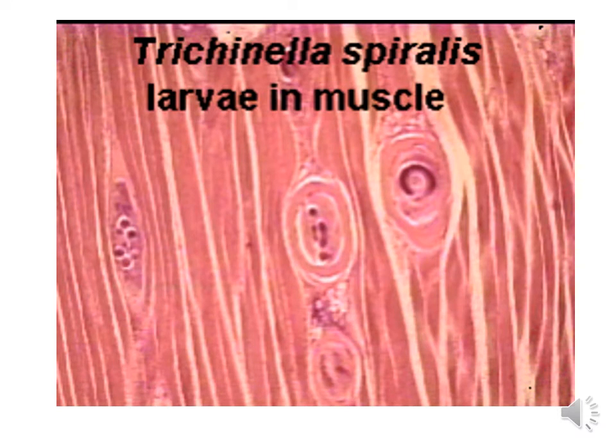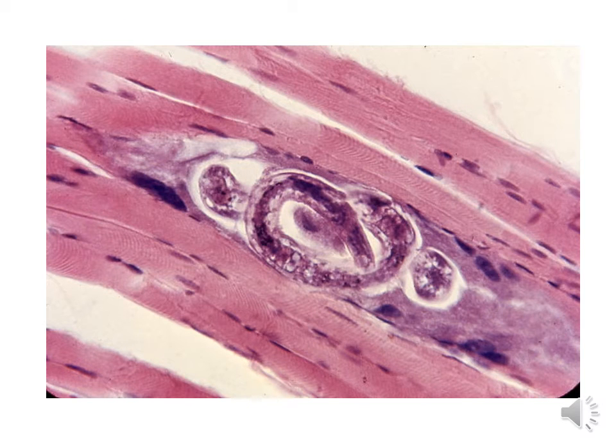Trichinella spiralis larva in the muscles, because Trichinella causes infection when people eat undercooked pork containing the encysted larvae. The encysted larvae will be released in the intestine, and then they become adult parasites, and it releases larvae which can enter the muscle, especially striated muscles, as you can see in this photograph. You see this is a larva or larvae in what is known as nurse cells, and usually this is taking place, as you can see the striations, so it is found in striated muscles. It survives for some time, and sometimes it dies and calcifies.